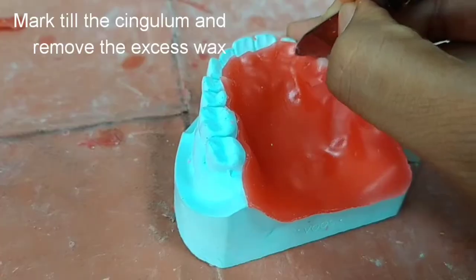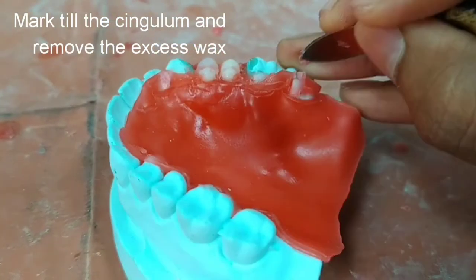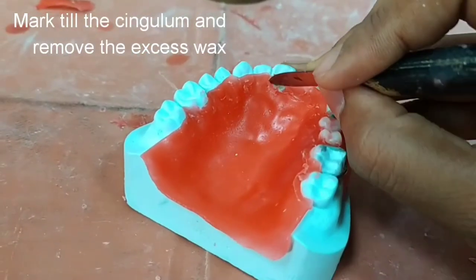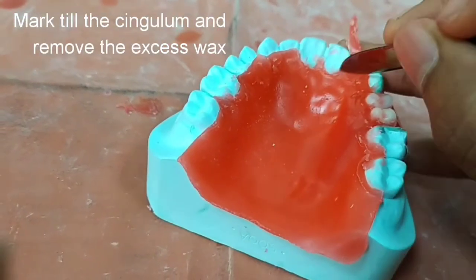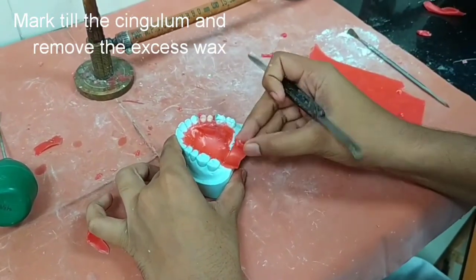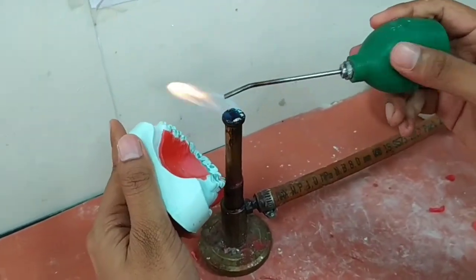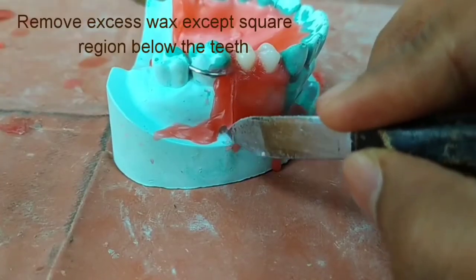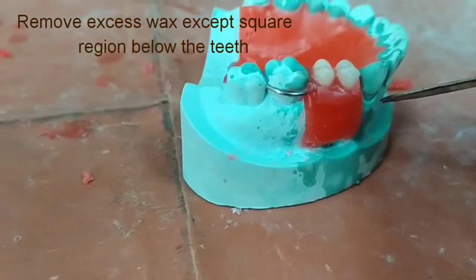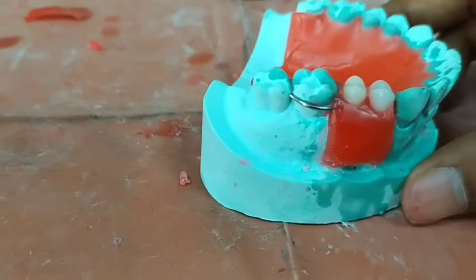Do the marking till the cingulum of all the teeth and remove the excess wax above it. Also cut it from the posterior region and remove the excess wax from the buccal region — only a square sheet just below the teeth should be present. Our wax pattern is ready.